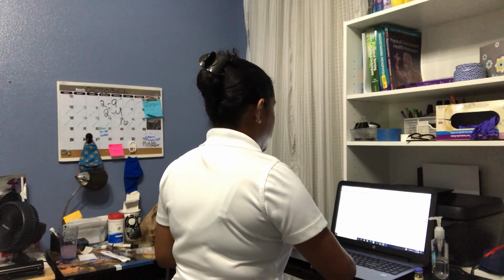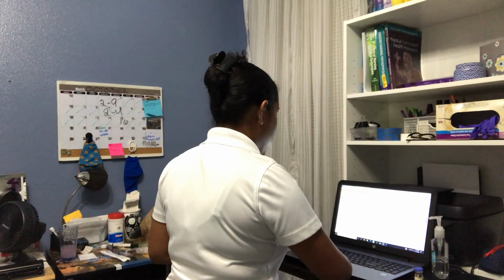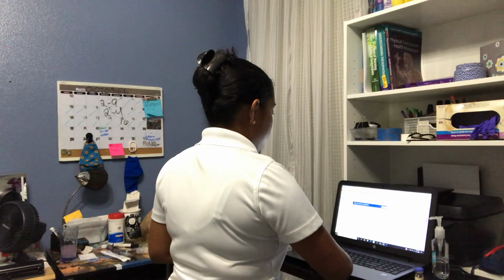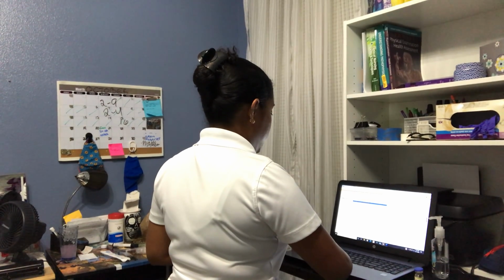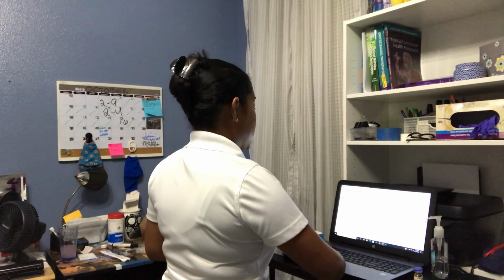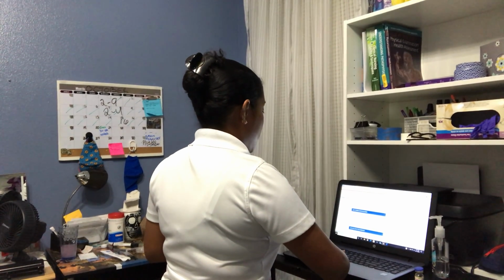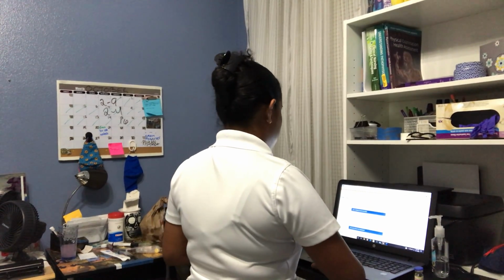At the same time, the patient does have a blood glucose level of 200, and there is an order for a medium dose insulin, and based on the sliding scale, they need 4 units. Alright, so based on that, I'm going to go into the healthcare provider's order and verify the information.